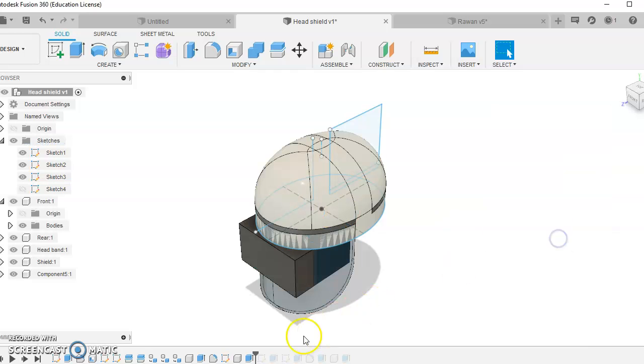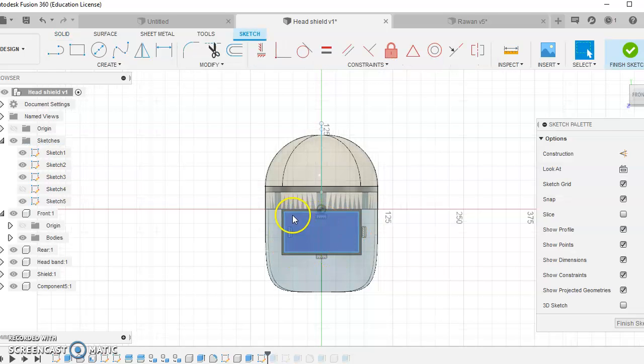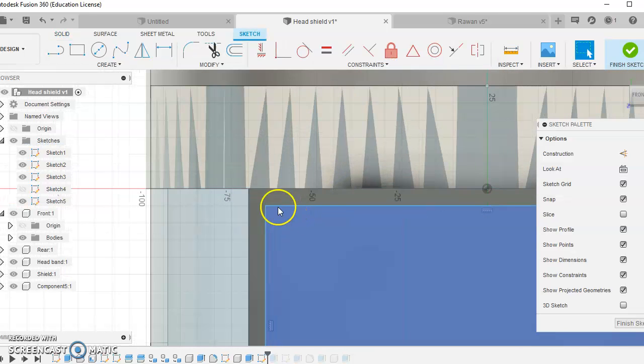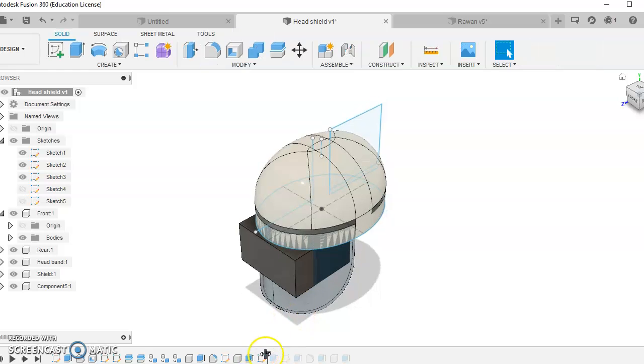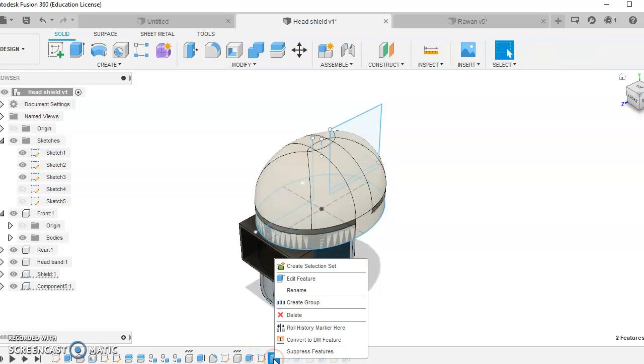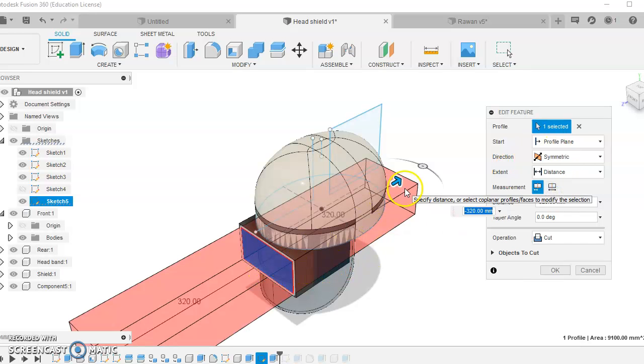Alright. So if you look on the next window here, I've then created a window inside that. So you can see I've gone in approximately 10 millimeters. So I've got an edge on there, and I'm going to cut that out. I'm going to delete all the way through. So with the delete function on the next part of the window, you can see here that I've deleted, edit feature. I've gone symmetrical through the component.